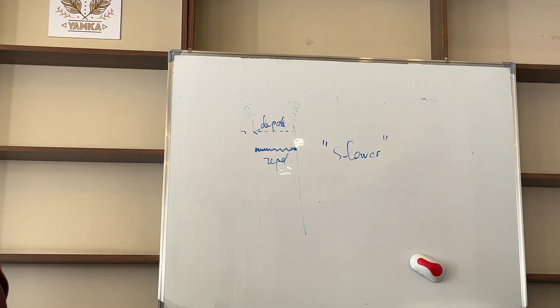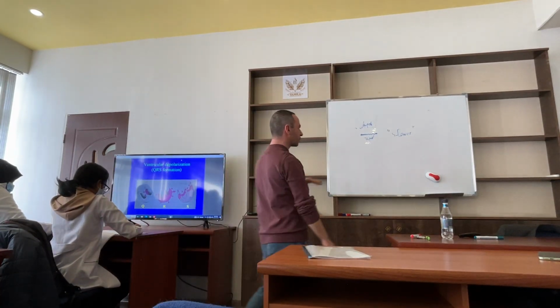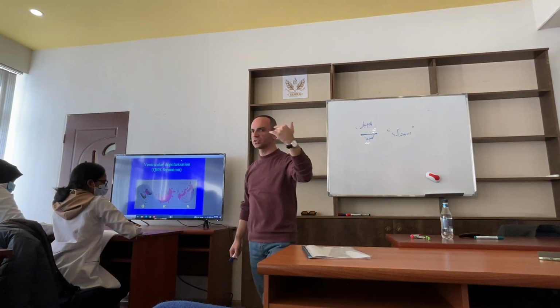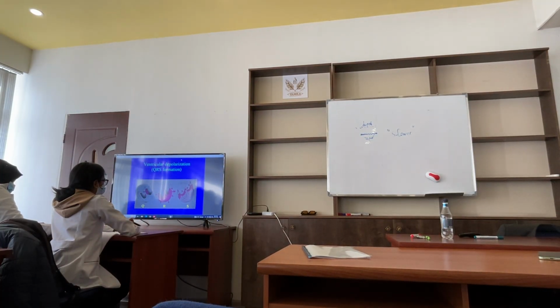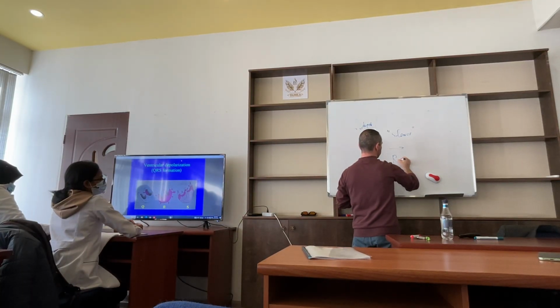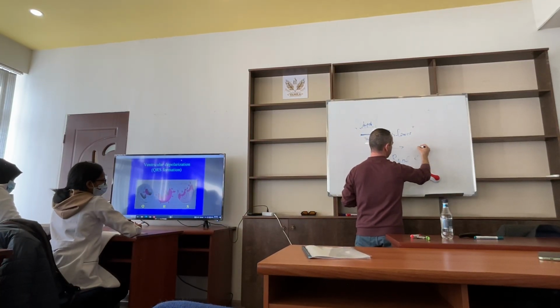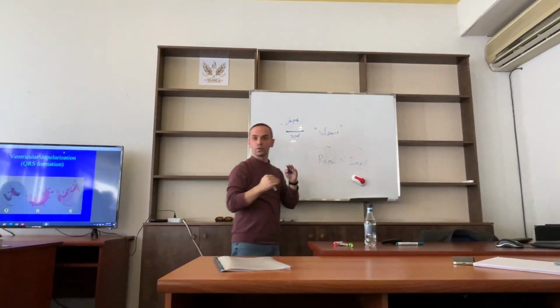That's why T wave is shorter than R, but is wider in duration. Okay? So 3 rules. Subendocardial to subepicardial is depolarization. Repolarization is opposite direction. Repolarization vector is smaller, and slower. Vector of repolarization is less than vector of depolarization, and it is also slower.